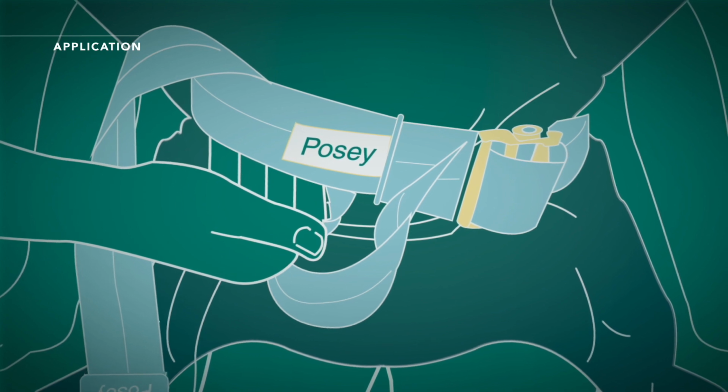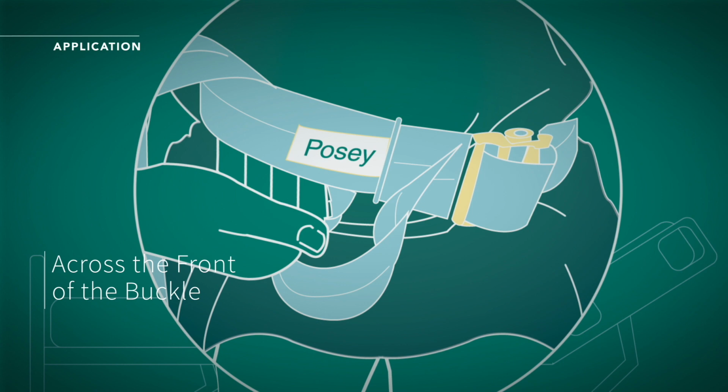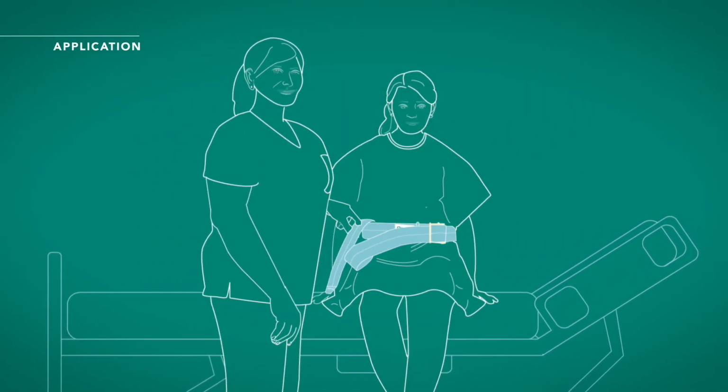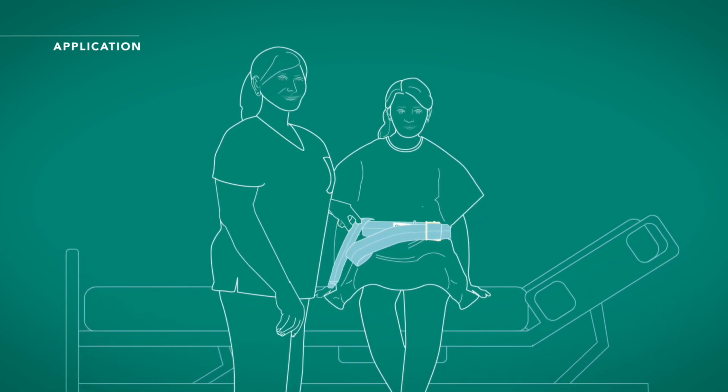Lay the strap flat across the buckle and tuck excess under the belt. Always verify proper closure before use. Always grasp the transfer belt from underneath while adhering to your facility's approved procedures.